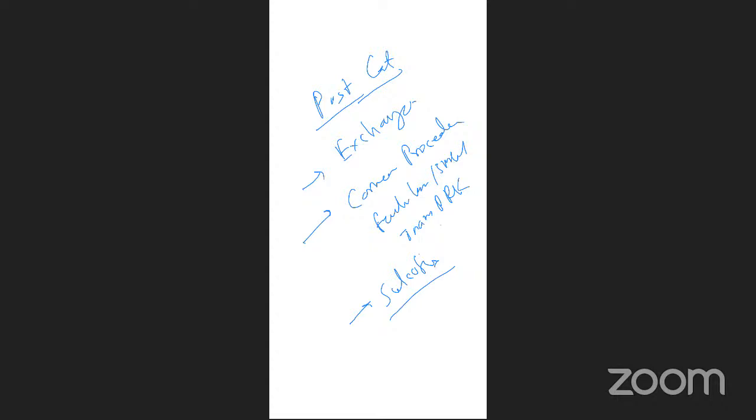So earlier the better, but of course, for the first 1 month, we generally don't do exchange unless it is evident that there might be a huge refractive surprise because of maybe calculation error or axial length error. In that case, we can immediately, like the next day or within a week, get to know that the IOL power is wrong, so we can exchange immediately.